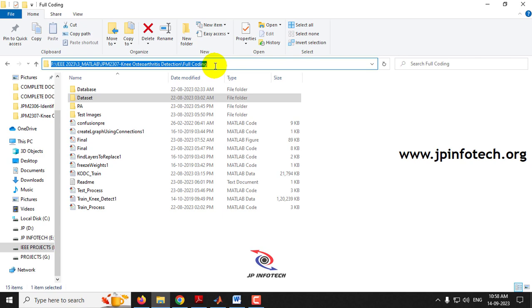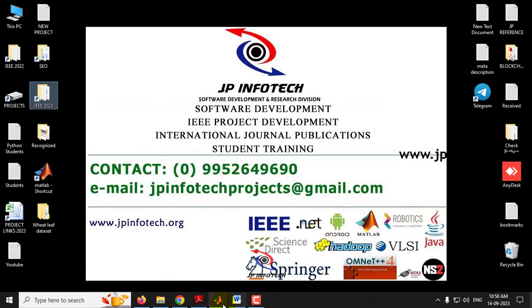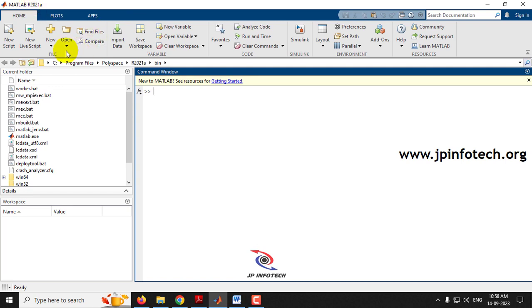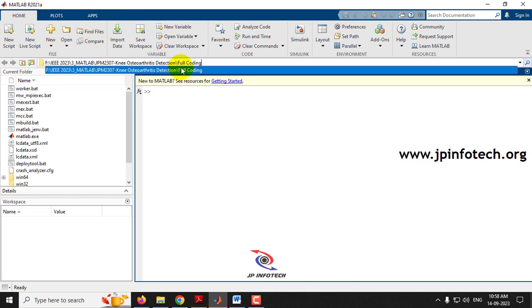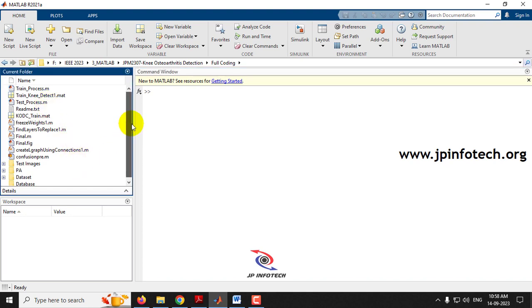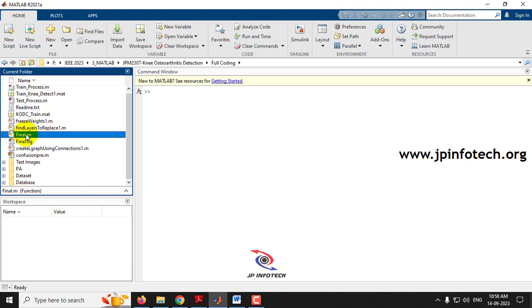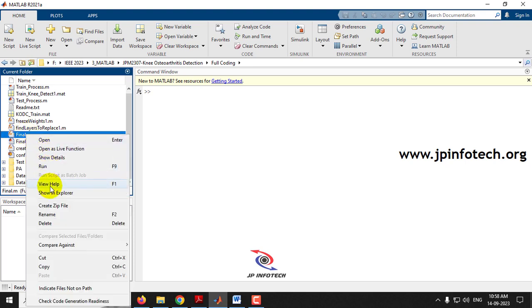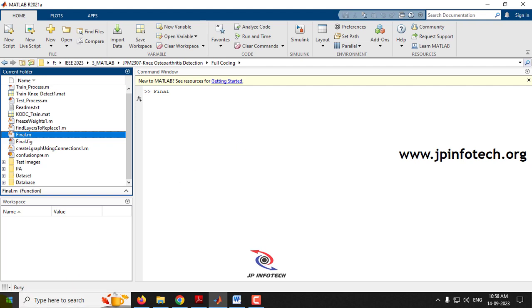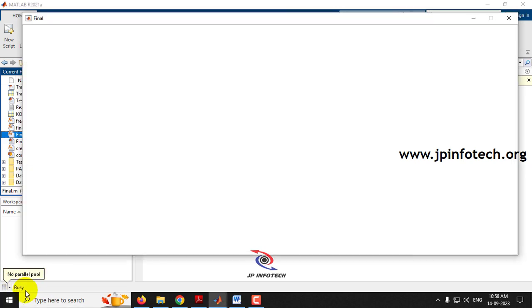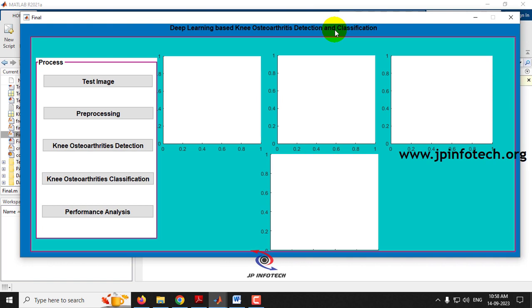First, go to the source code location and copy it. Now open MATLAB 2021A. In the address bar, paste the location and click Enter. You can see the code has been loaded in the left side panel. Select the final.m file, right-click it, and click Run. Now you can see the GUI of our project, which has the proposed title: Deep Learning Based Knee Osteoarthritis Detection and Classification. It has the process buttons: test image, pre-processing, knee osteoarthritis detection, knee osteoarthritis classification, and performance analysis, as mentioned in the modules.